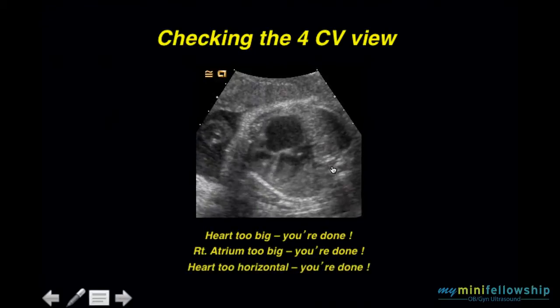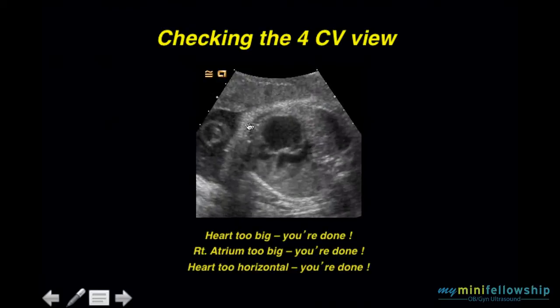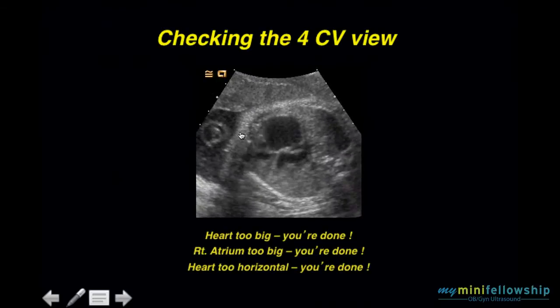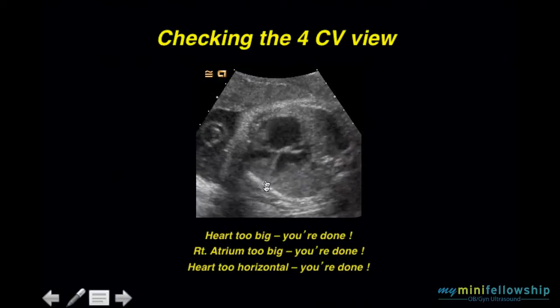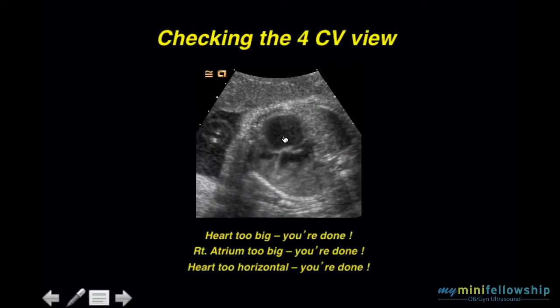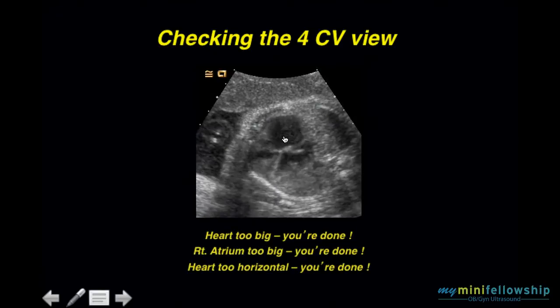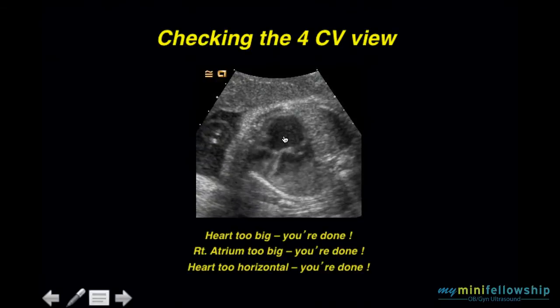If you noted that the heart was too horizontal — you drew your mid-sagittal line and the line through the interventricular septum and noticed that it was too horizontal — you're done.